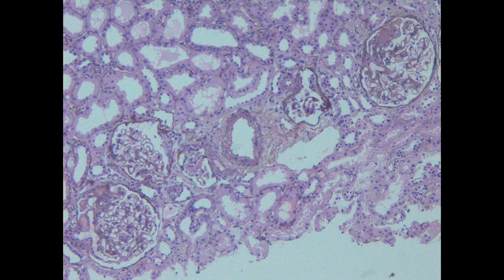So as the disease progresses, you can find it in membranous also, and this is commonly seen in advanced membranous, you'll find segmental sclerosis. It is said that those patients who have segmental sclerosis or FSGS lesion in membranous glomerulonephritis have more massive proteinuria. They can have renal dysfunction also. They have more hypertension, and they progress to end-stage renal disease more rapidly.